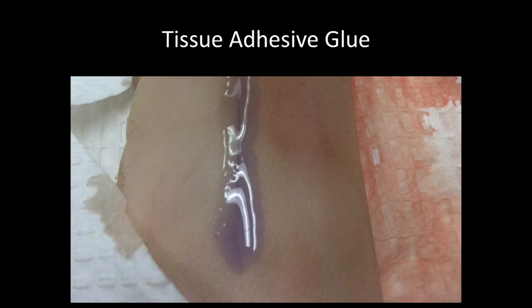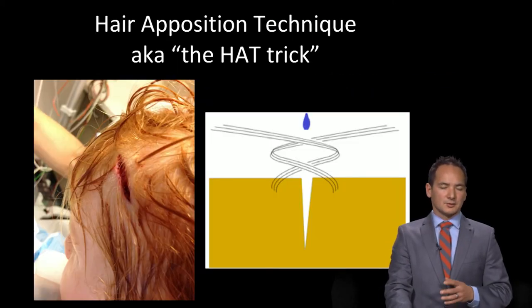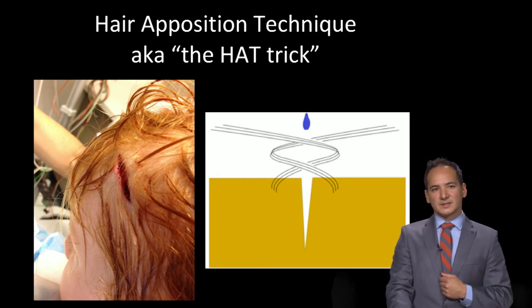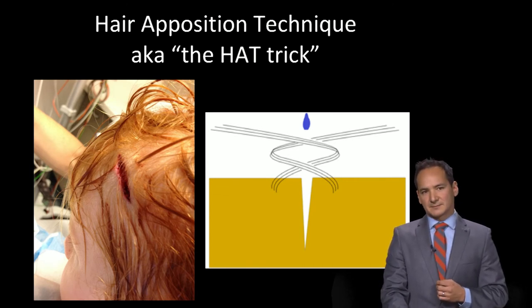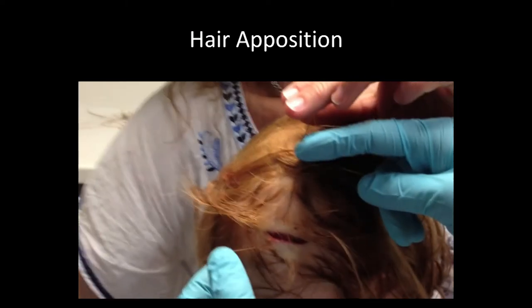There are also ways to use tissue adhesive glue creatively in order to close wounds that you see on hair-bearing areas like the scalp. For example, the hair apposition technique is a really great tool for use in children who have longer hair in order to close scalp lacerations. So this young girl had a fairly long scalp laceration. I considered stapling it, but that would have been pretty scary for this young kid. So here's what we did instead.